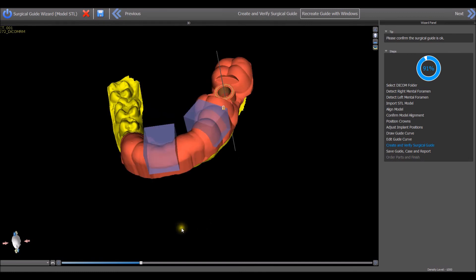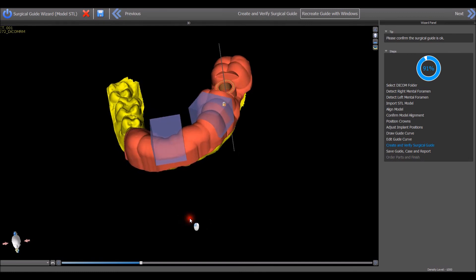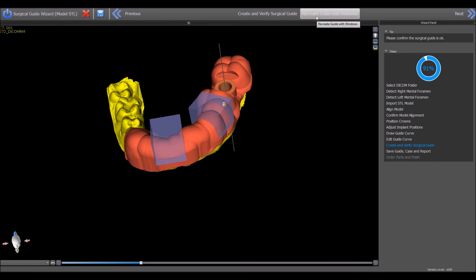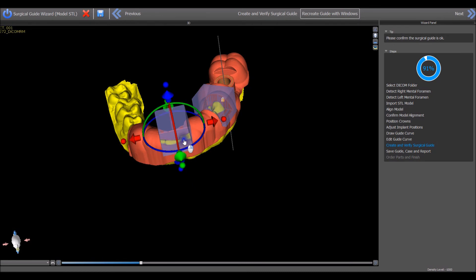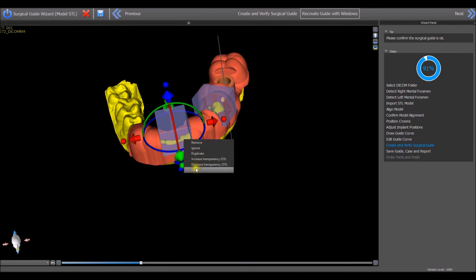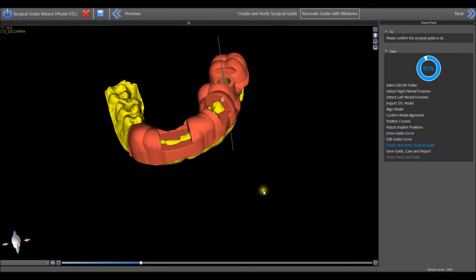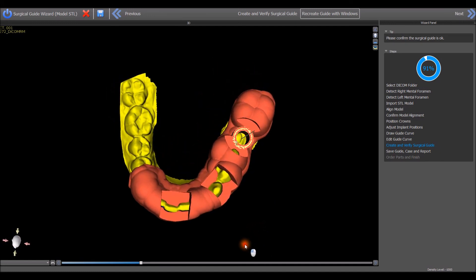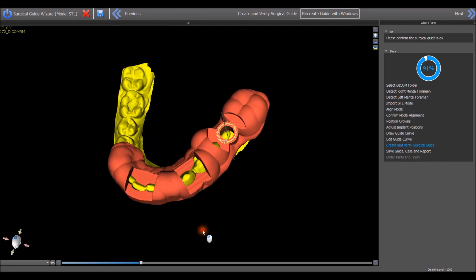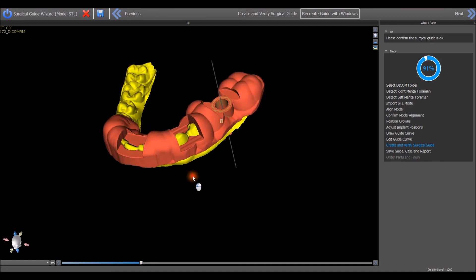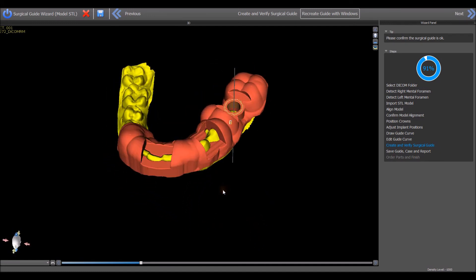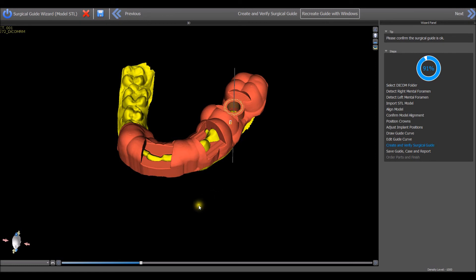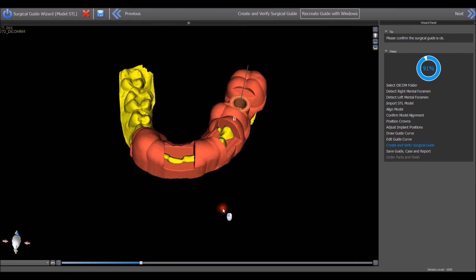Once the location of the blocks and the future windows have been finalized, click on the button recreate guide with windows. The newly created surgical guide will now appear on the screen. The user should now continue with the wizard process pressing the next button to advance to the next step.